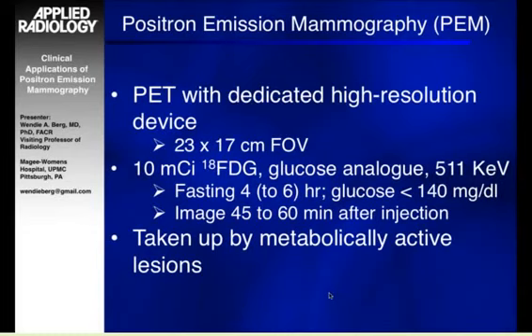And again, FDG is taken up by metabolically active lesions, so you will see uptake in actively dividing fibroadenomas, inflammatory change, some papillomas, and some atypical lesions as well as cancers.